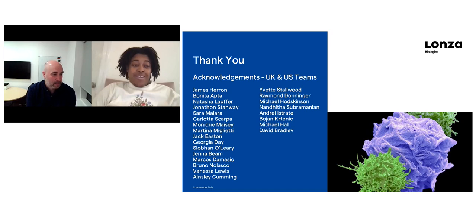Great. And we actually just got one more in as you were answering that one. For the MAB or ADC treatment with DC cells, do you have suggestions for the protein concentrations? Yeah, so across the industry, you'll see people using anything between 10 and 100 micrograms per mil. We typically use around 50 micrograms per mil, which is about 300 nanomolar for a standard IgG1. That's an important consideration that I haven't discussed here: if we're trying to test head-to-head slightly different molecules that have different sizes or different beads on a string or add-ons to the antibody, it's often important to use the molar concentration, so we're looking at it per molecule rather than weight of protein.